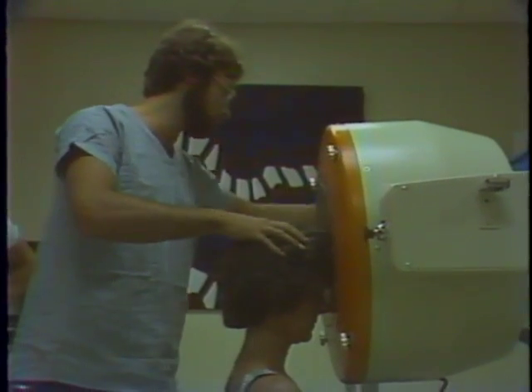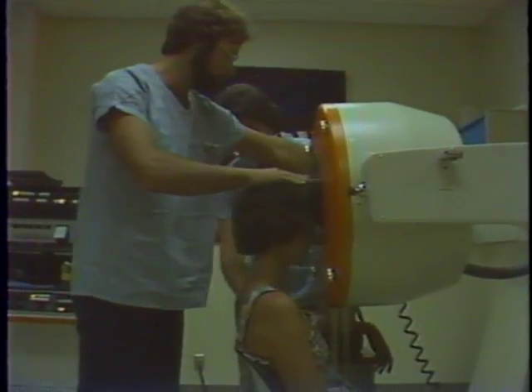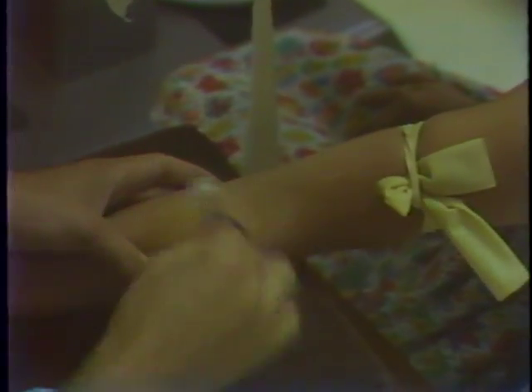We're going to look at blood flow to the head in this patient, say, and the technologist positions her head in front of the gamma camera. The other technologist comes over and starts getting her arm ready for the injection that we're going to have to make into a vein. He just ties a tourniquet around the patient's arm, and this is an ordinary venipuncture, just like you get when you draw blood, except this time we're going to put in a very small amount of radioactive material. Isn't that dangerous?